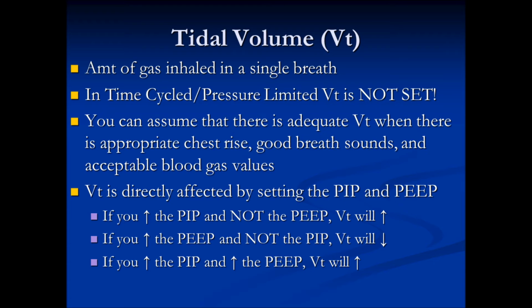Either we're going to make a change to affect ventilation and then get a blood gas, or we're going to make a change to affect oxygenation and then get a blood gas. In the MBRC hospital, you will never make two of those changes at the same time. You will never be given an option to manipulate something to affect ventilation and oxygenation. I'll say mostly never, because there may be one or two incidences where someone will say, hey, I had a test question and they actually asked me to do both.